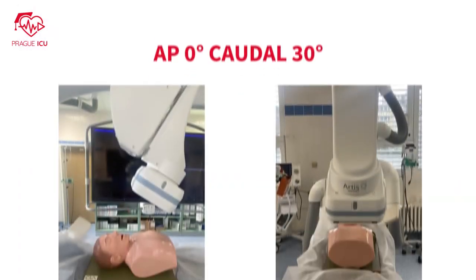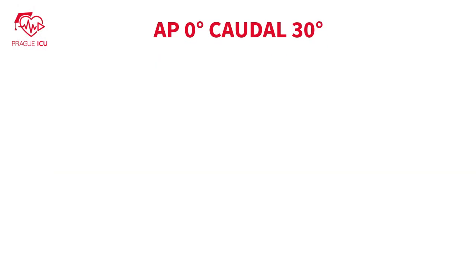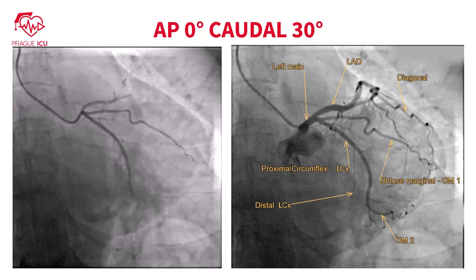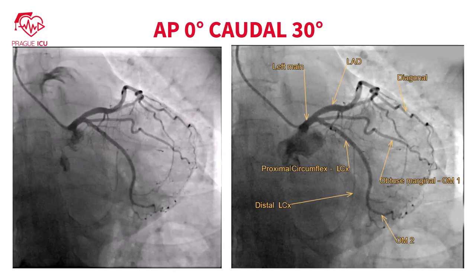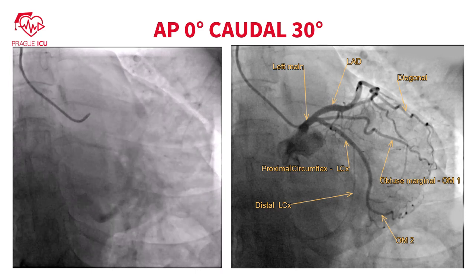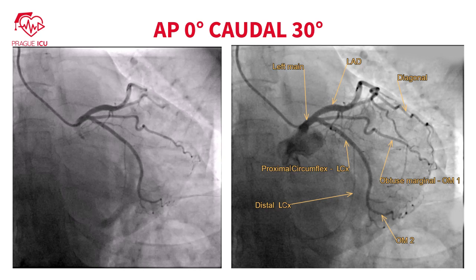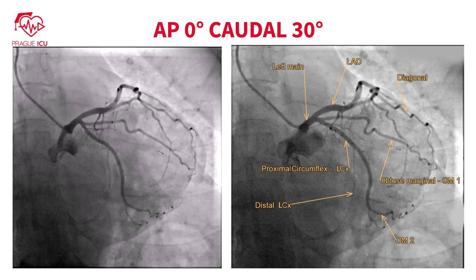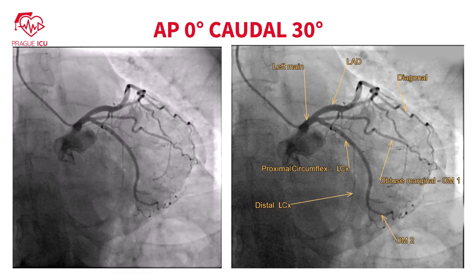AP 0 degrees caudal 30 degrees view is best for visualizing proximal circumflex and circumflex obtuse marginal bifurcations. Circumflex is usually tiny. All branches go to the right side of the image towards the LAD. Circumflex heads always towards the coronary sinus.